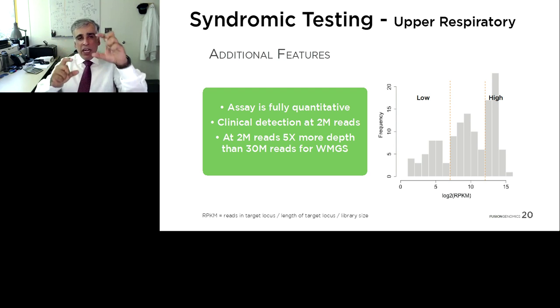So in that, if you remember, we talked about that in a whole metagenome, you take the tube and you sequence everything. Well, if you want to really sequence everything in that tube, all possible DNA, RNA in it, that would still cost in excess of $20,000, $30,000. But what people do is they sequence anywhere from 10 to 30 million reads, a sampling of the DNA from that tube.